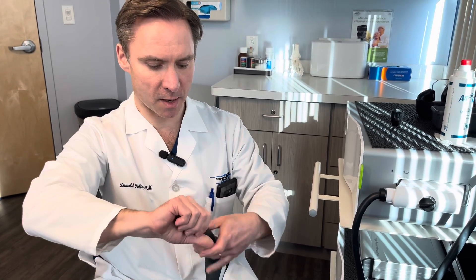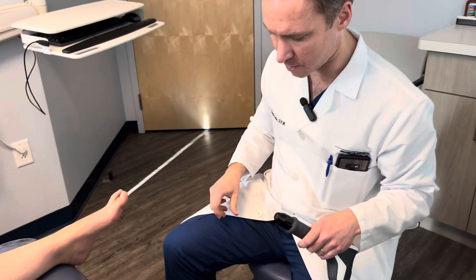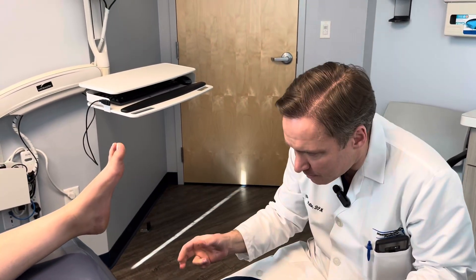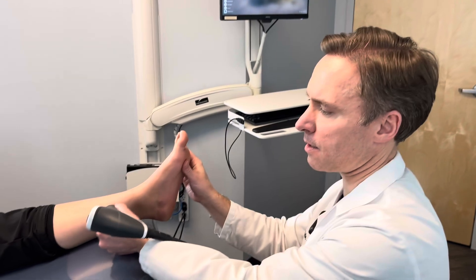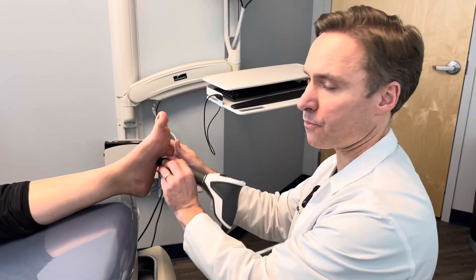So this is how we set it up. When positioning, one of the keys to doing shockwave is you want to position the patient so you don't have to bend around a lot — you want it right at eye level. When I do shockwave, I usually start a little bit on the posterior tibial tendon and then go down to the foot region.